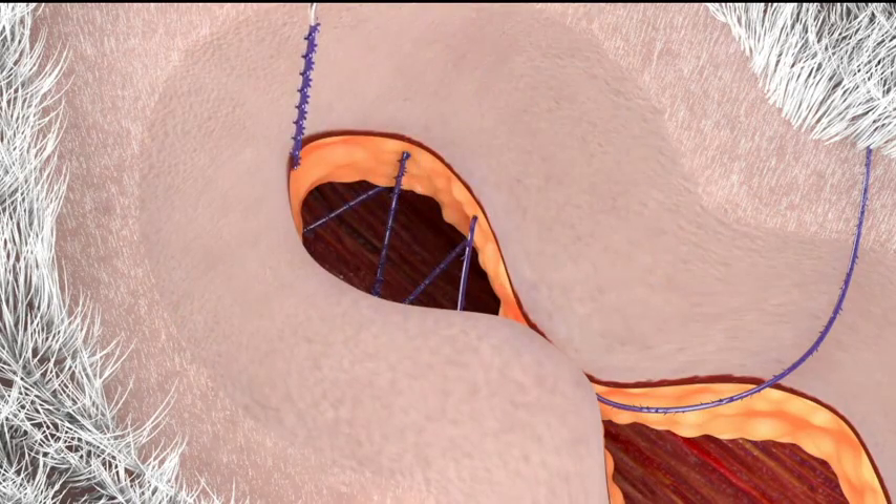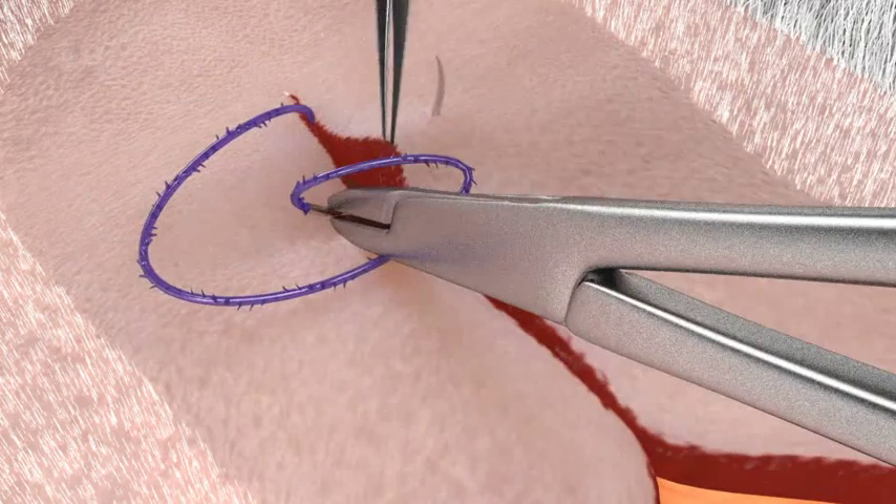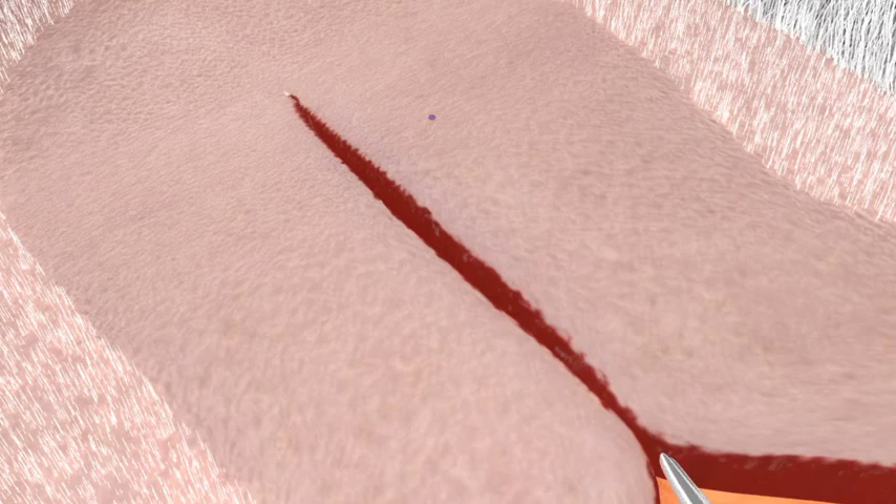Once the apex of the wound is reached, make the appropriate backstitch with the first arm by exiting lateral to the incision and cutting the remaining quill device flush with the skin.